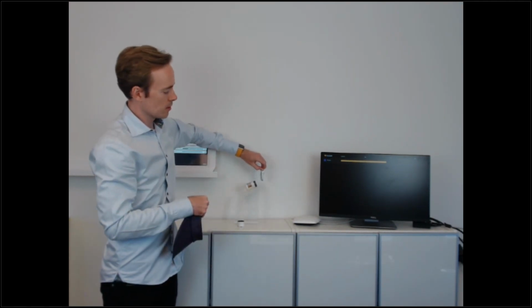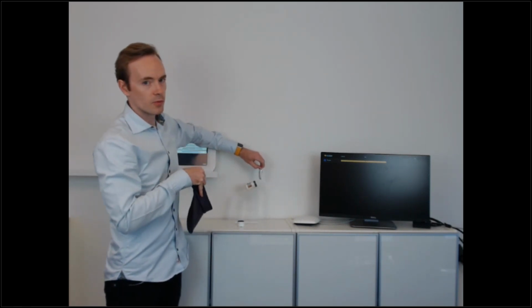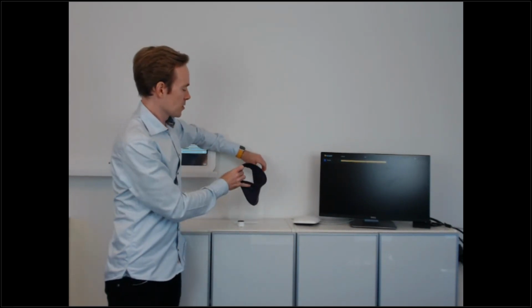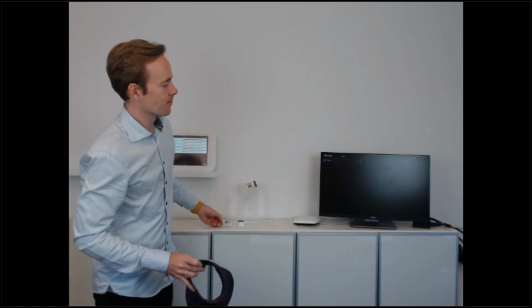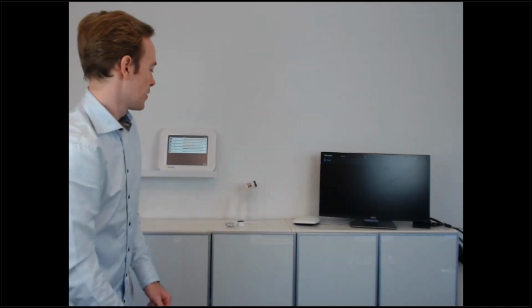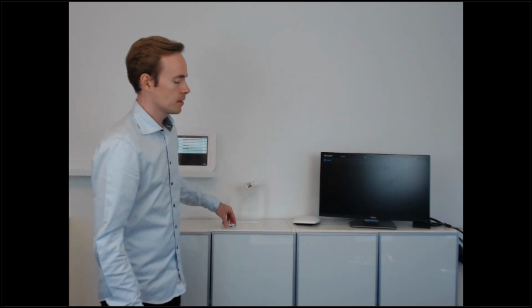And again, you can see I'm at roughly 2 millisieverts per hour. And the i3 system reminds me that, hey, Fredrik, you should use the shield. Oops. So let's insert the shield in between. See what happens. It goes down to below 0.2. So I can see I reduced my dose rate by roughly 90–95% by remembering the shield. And that way, again, I have avoided unnecessary radiation exposure. So let me cover this up again.